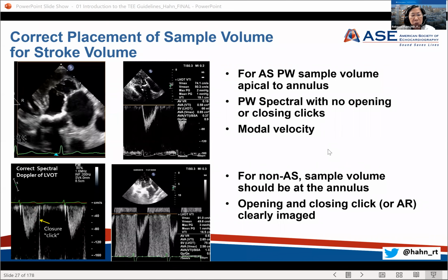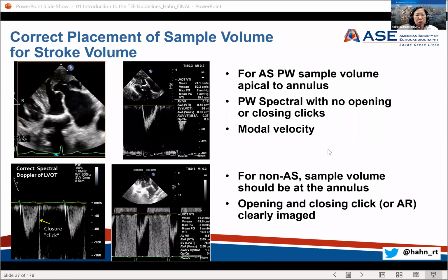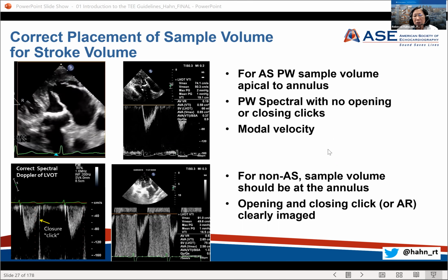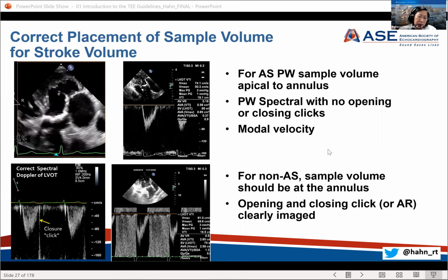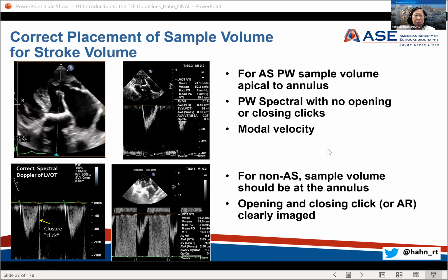Now, in the setting of aortic regurgitation, obviously you may actually see the aortic regurgitation. So a little tough to know precisely, but you can really see how beautifully laminar the last figure on the lower right-hand side is. And that, again, is an appropriate position of the Doppler for aortic regurgitation. Now, if you have flow acceleration because of HOCM and systolic anterior motion or a hyperdynamic LV, now all of a sudden it's much more difficult because you've got acceleration of flow that you can't account for.